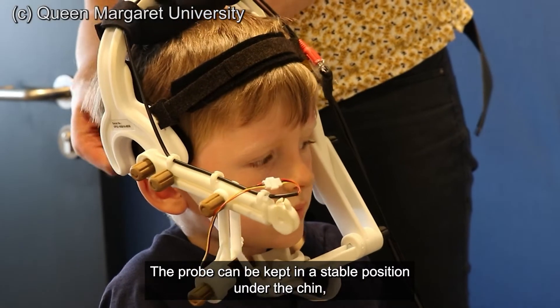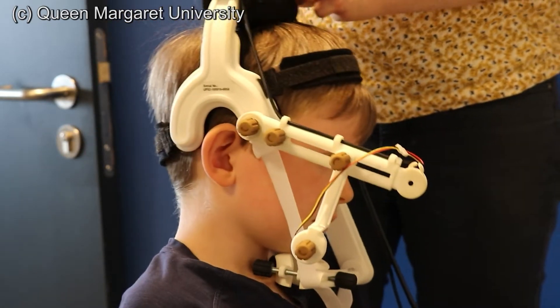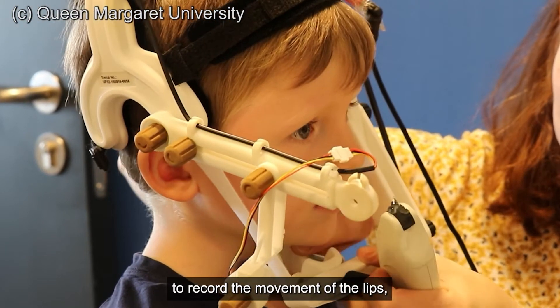The probe can be kept in a stable position under the chin using the UltraFit headset. A velcro strap helps hold the headset firmly in place. The headset has a small camera to record the movement of the lips.